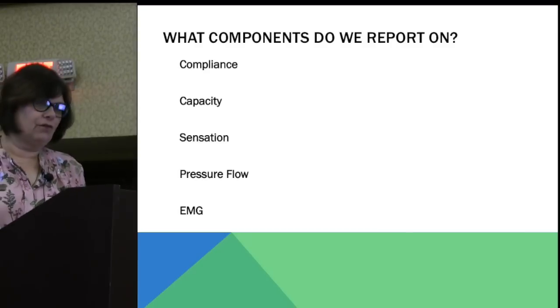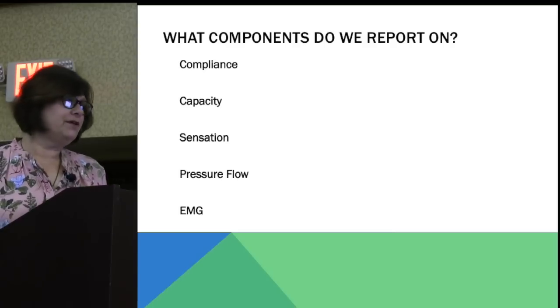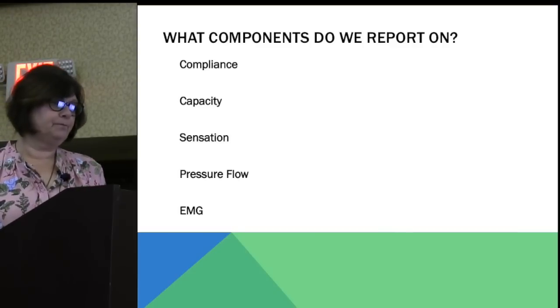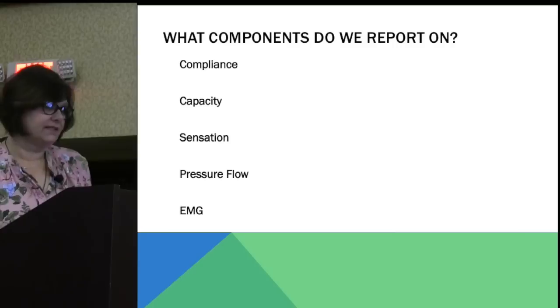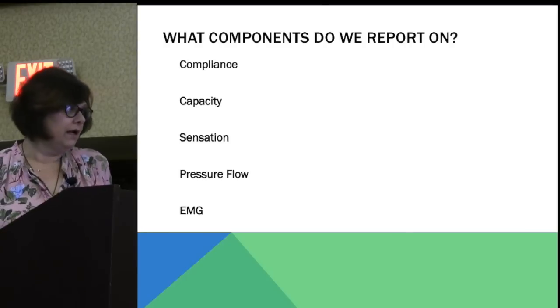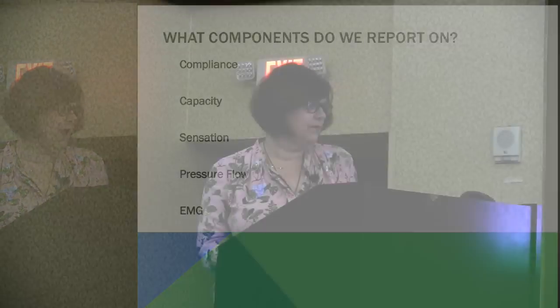These are people who fill rather quickly. And the problem there is that if the pressure is rising inside the bladder, so that rising pressure line on the vesical and detrusor line, we are often thinking, is there reflux? Is urine refluxing back up into the kidneys? You've got this high pressure. If it's not coming out through the urethra, where is it going? It could be going back up the ureters into the kidneys, right?